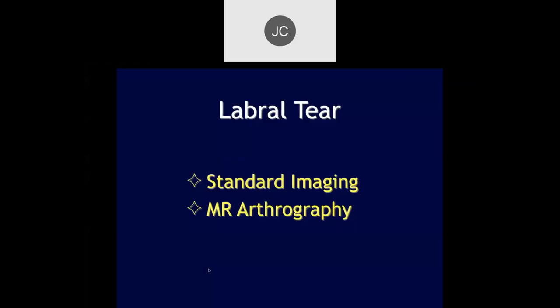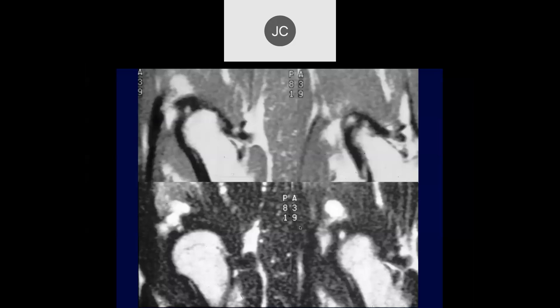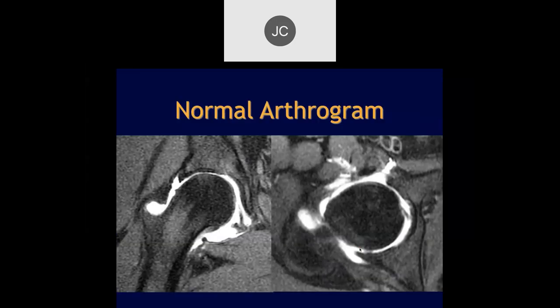Let's talk about labral tears. We can use regular MR imaging or MR arthrography. Some of these cases are old cases — here's an old case showing a labral tear in this location. The imaging we have now is much better. Here are some early arthrograms where you can see the arthrographic material inside the joint space and a normal superior labrum.